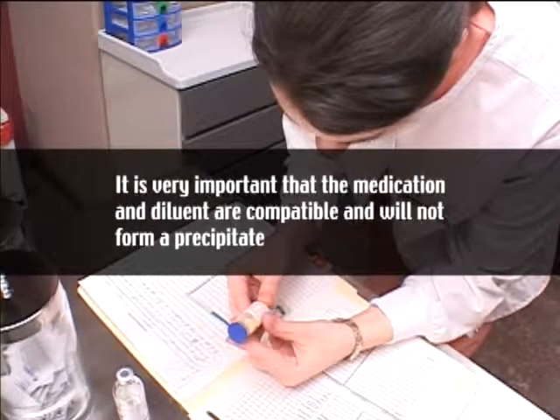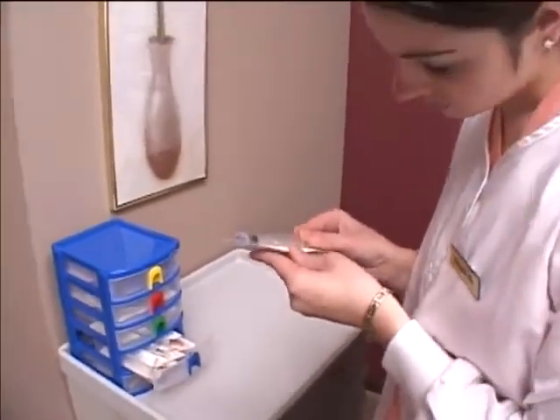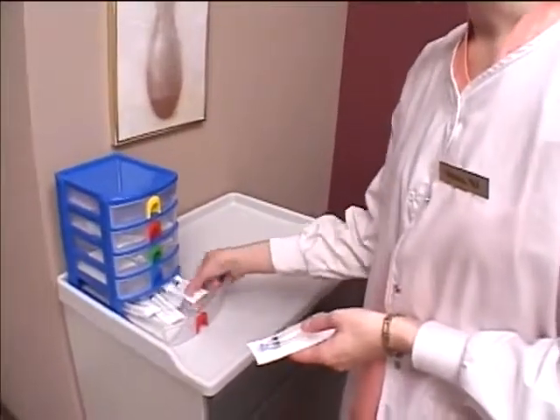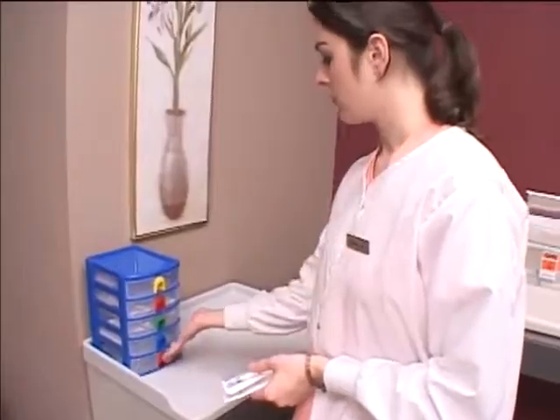Check medication order for specific instructions. Determine the route the medication will be delivered to ascertain what size syringe and needle will be needed. Remember, you will need a separate syringe to draw up the diluent and to draw up the mixed medication.